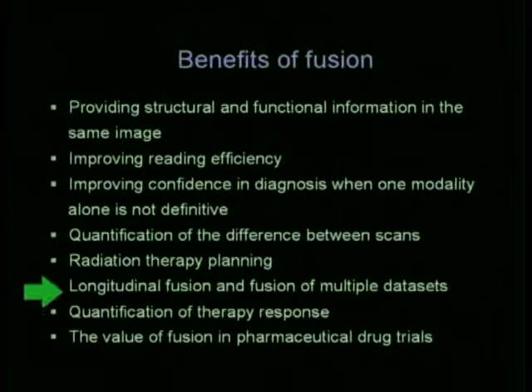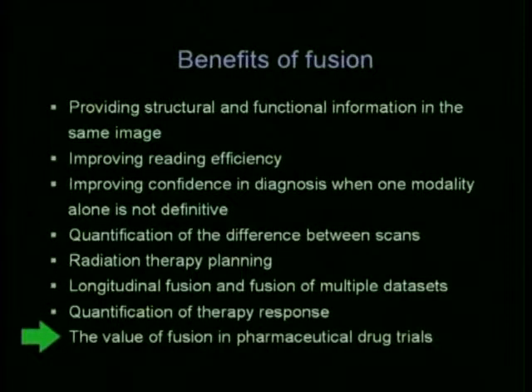You can have a longitudinal fusion or fusion of multiple data sets, and of course you can do a pharmaceutical drug trial, you can do this kind of a fusion.